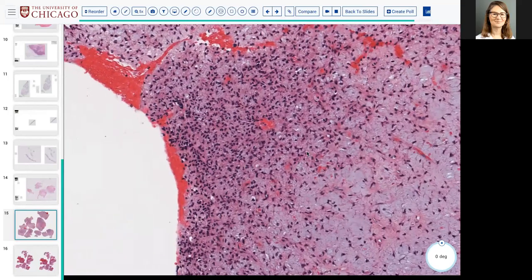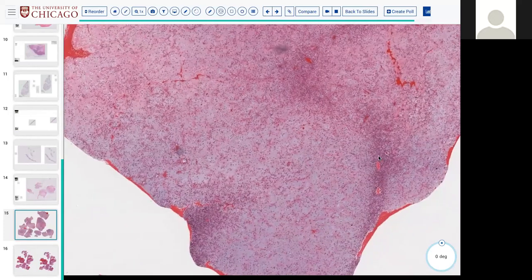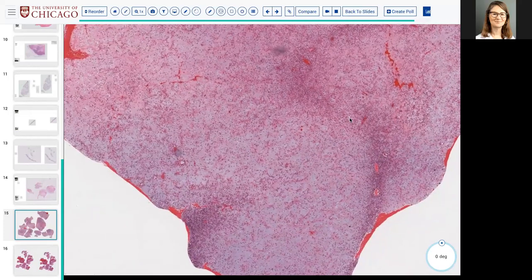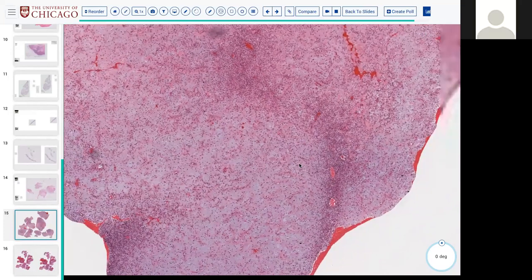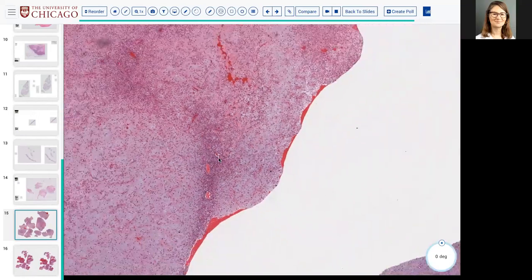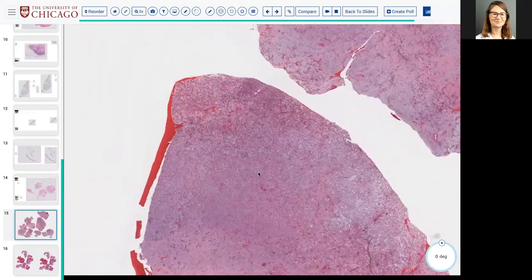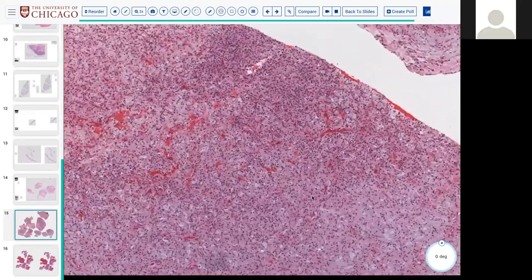Yes, and I haven't told you where this is. My bad. Do you want to know where it is, or should I have you struggle? No, just kidding. This is now a bony lesion. Okay, does that help? Somewhat, yes. This is no longer a soft tissue lesion. This is an osseous lesion in a young person. Okay, that does help a little bit.